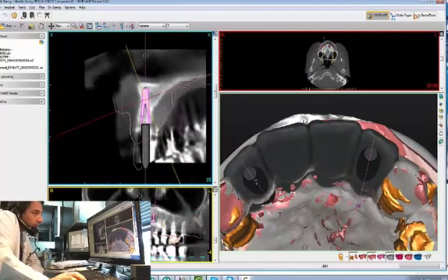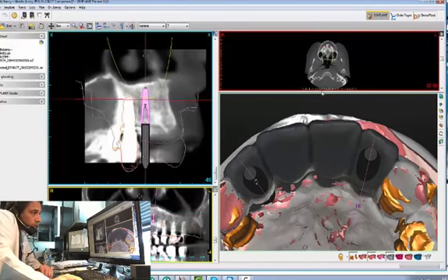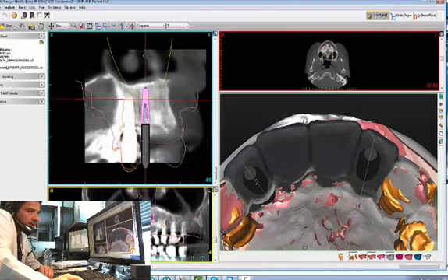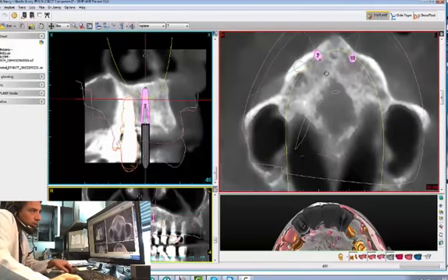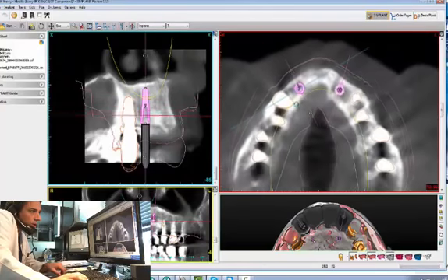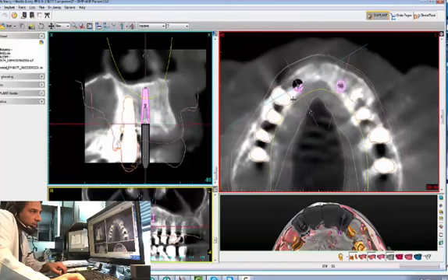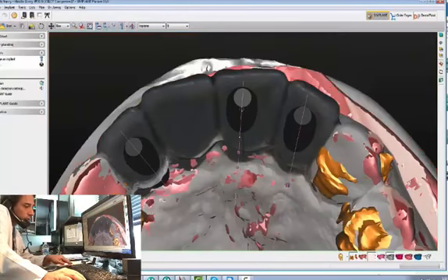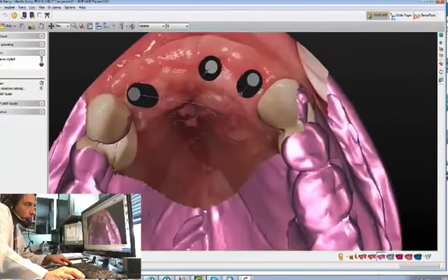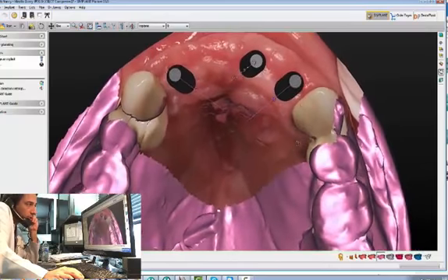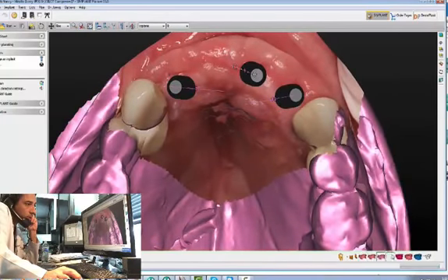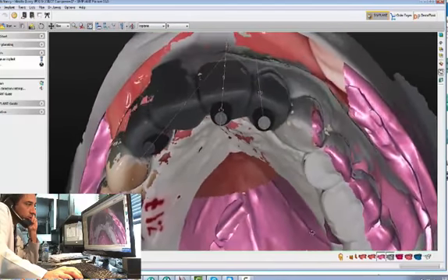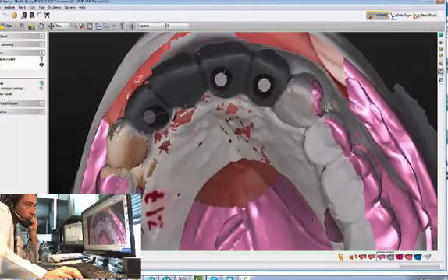Before we move on, let's see if we're not too close to the tooth. This is the canine here — number six. Is that an implant or a tooth? I'm not sure. She has a bunch of implants. The way we do it: you see number seven — I'm walking along the seven implant, and around the platform, you're almost two millimeters in distance. So it's pretty close, but it's still a safe distance. Let's look at different angles just to make sure we are all on the same page. If you throw the wax-up on top of it, that's what you can expect.